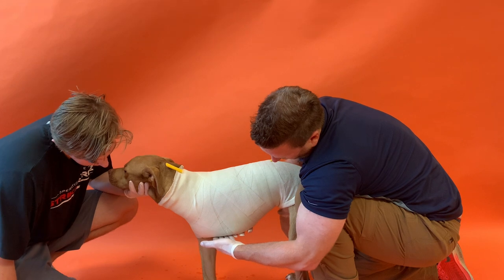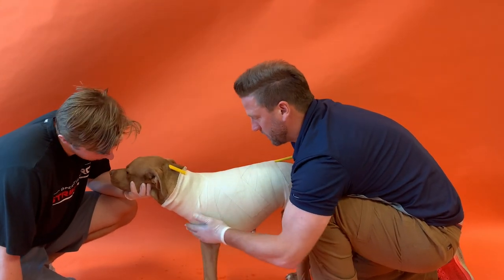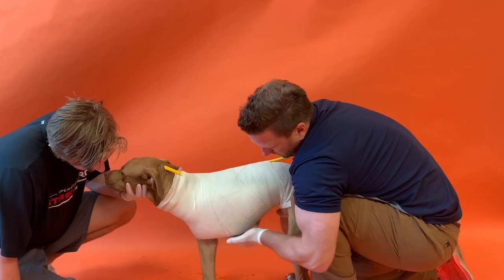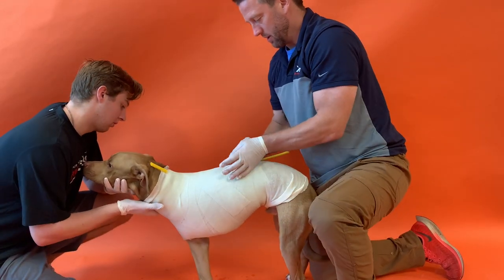After the cast is cured and removed, take a measurement from the lowest part of the body to the floor — that gives us the height measurement to fit the prosthetic leg. Measure straight from the bottom of the chest right down to the floor.